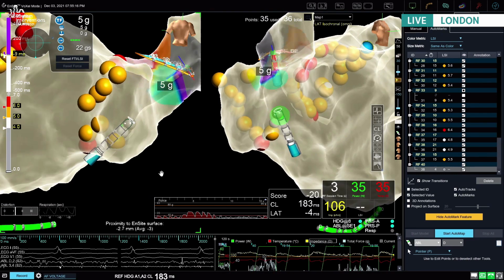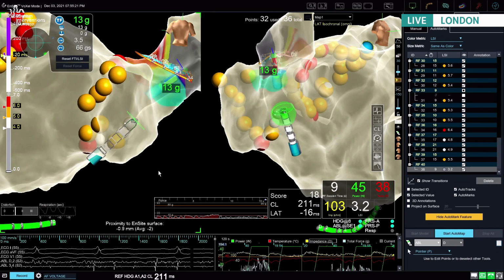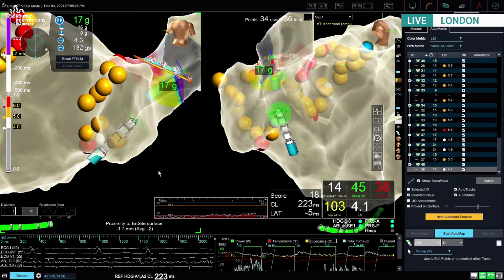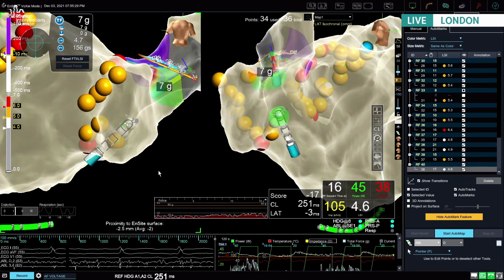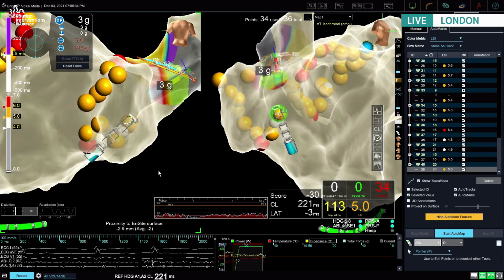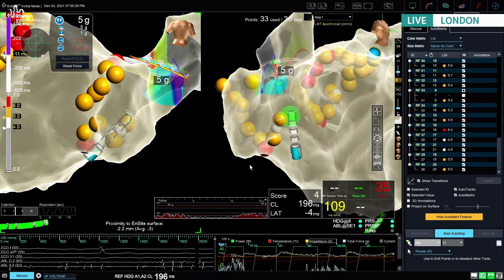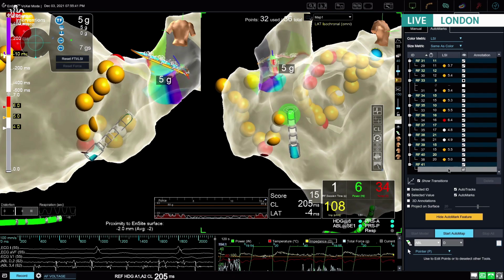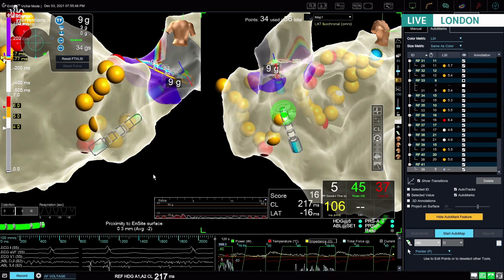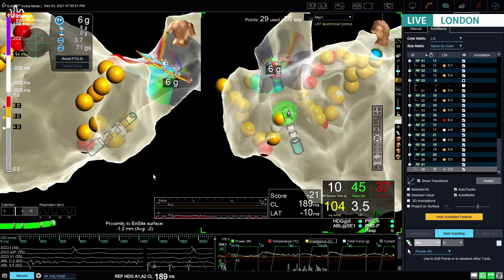So we've moved on past that and been planning subsequent studies, partnering with the larger 3D mapping companies. There's something in progress preparing a version of STAR that will be compatible with EnSite, the intention being to allow people to run their own independent studies using EnSite and STAR mapping. However, that is still in development, so that's not what we're looking at today. So far, this is pulmonary vein isolation using EnSite X and nothing other than that.